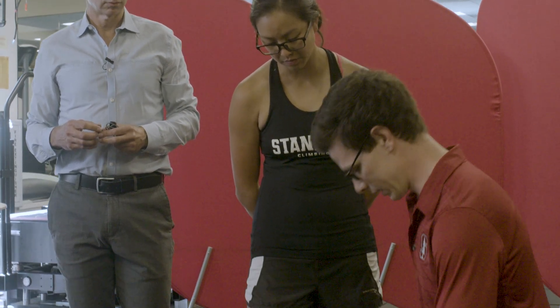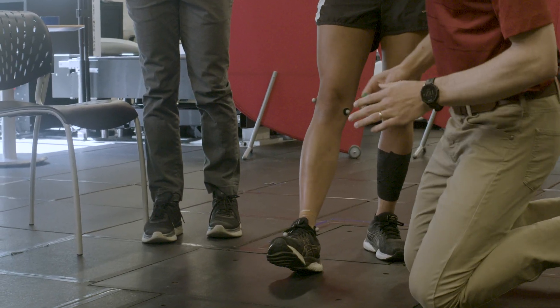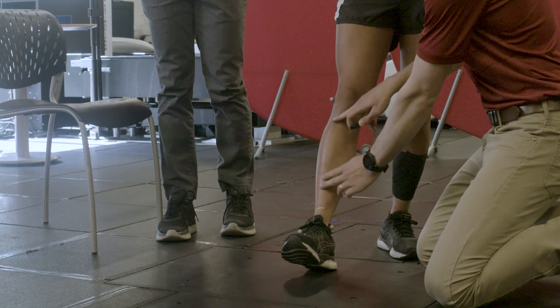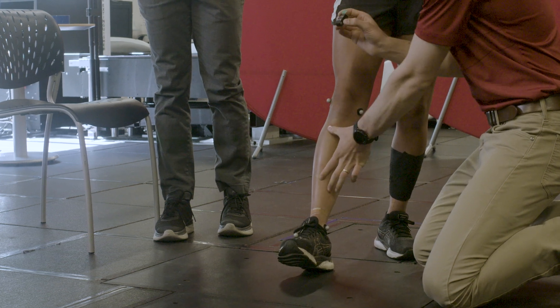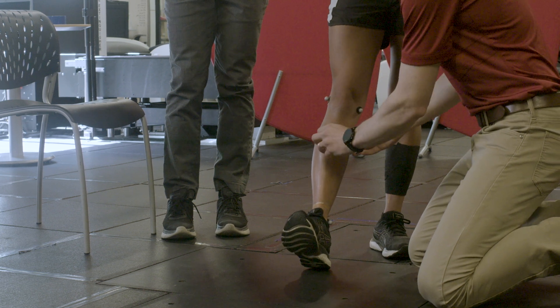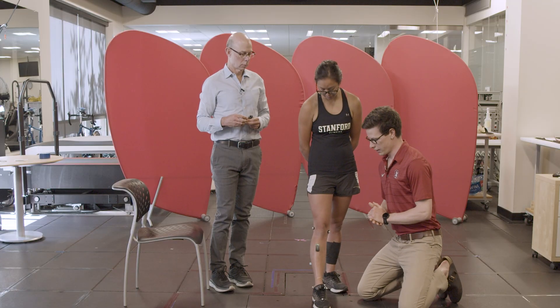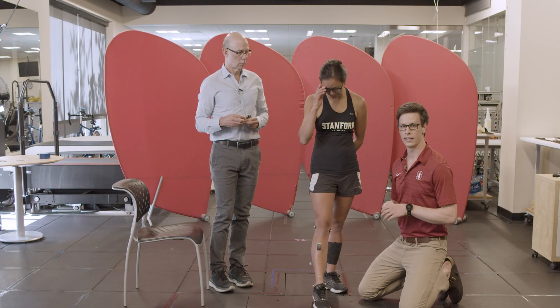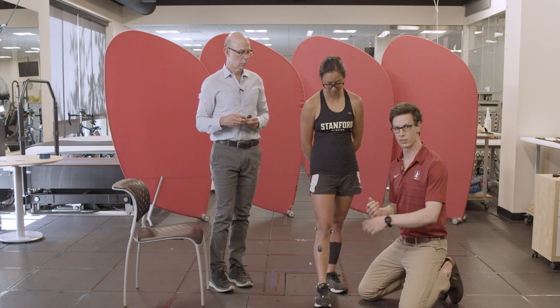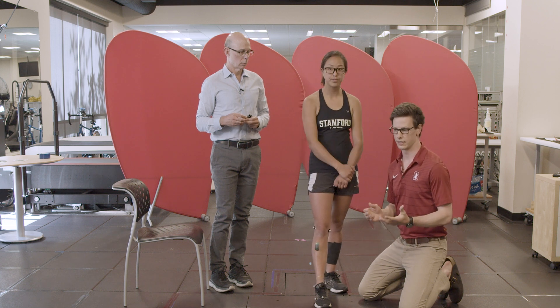We'll put on the tibialis anterior electrode. As we place these, we palpate the muscle and we know the origin and insertion points, so we know generally where the muscle's running. We find the tibialis anterior and put the electrode parallel to the muscle fibers so that we're measuring the voltage differential along the muscle fiber. What's important to note is that even in the same day, if we remove and replace the electrode in the same spot while she's doing the exact same muscle activation, we get slightly different values.